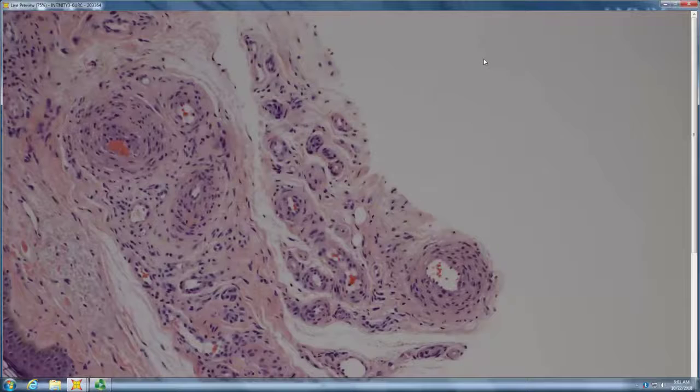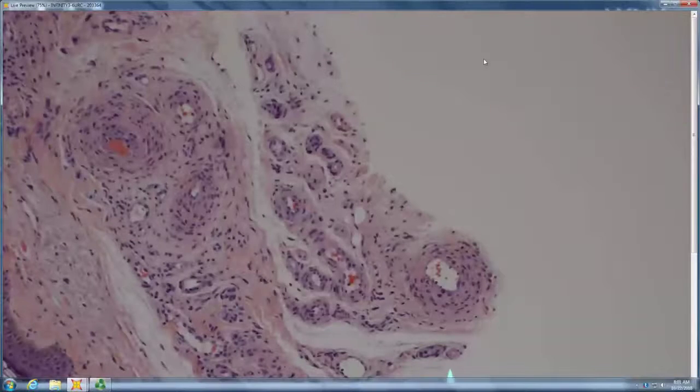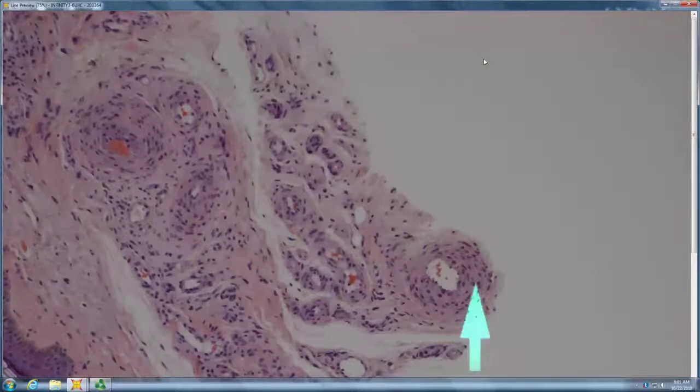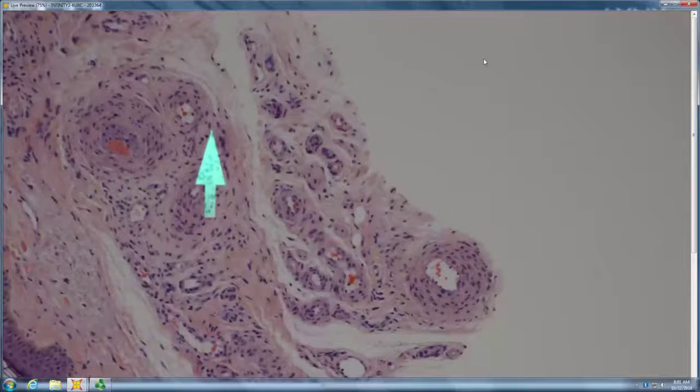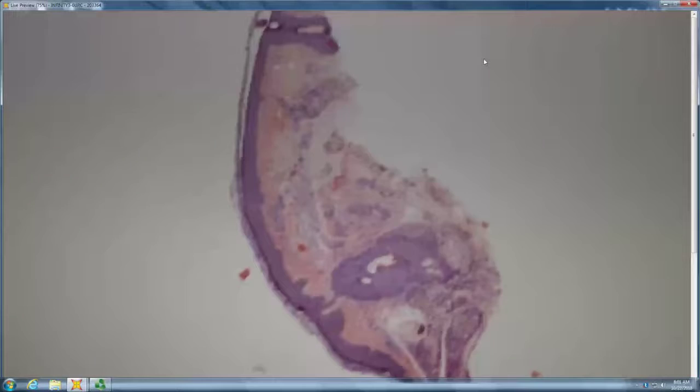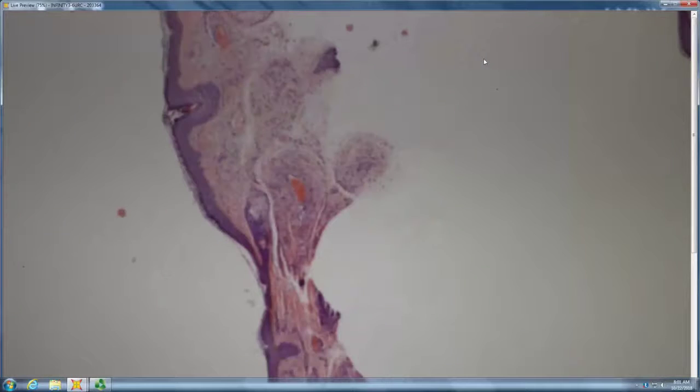It's going to be like stasis. There is a nodular angioplasia in stasis. Is it of thick-walled vessels or very thin-walled vessels? Thin-walled but hyalinized vessels. This is a thick muscular wall, but then they're also thin-walled. They're thick and thin here. So thick and thin walls, maybe like an AVM. Yeah, exactly. So arteriovenous malformation, arteriovenous hemangioma, whichever you want to call it.